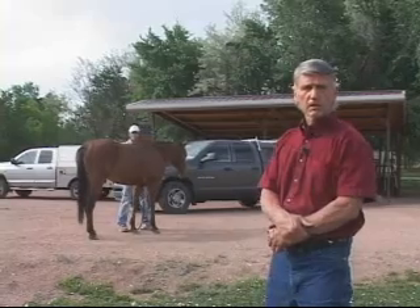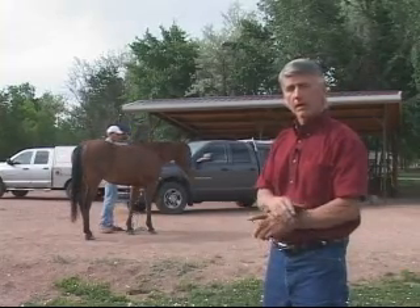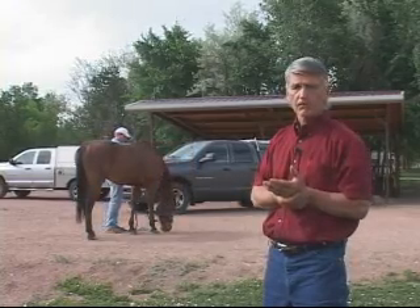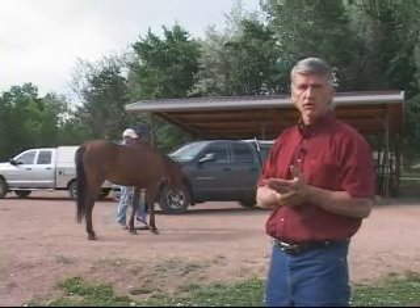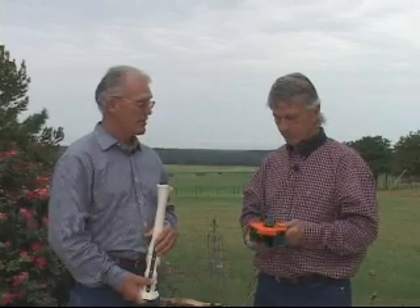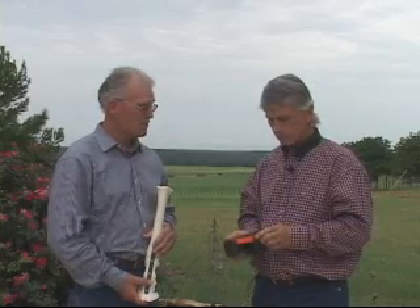The thing that seems missing in a lot of treatment protocols is asking the horse where they really hurt. And most importantly, not just exactly where they hurt, but what makes them feel good. And if you can make them feel good and give that to them 24-7, they're eventually going to heal sensibly. It's a very interesting approach, and I think it lets them be a more active participant in what's going on, and that's not always the case with some of the decisions we make for them.